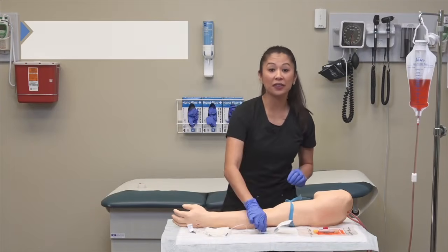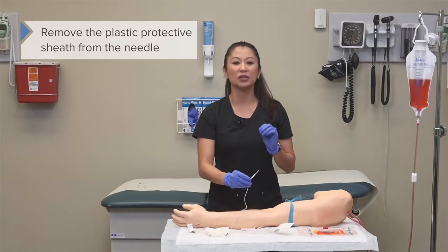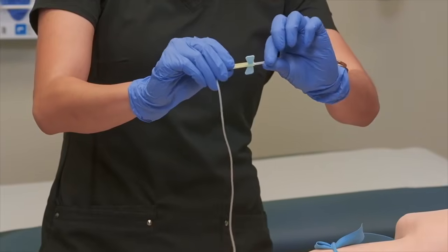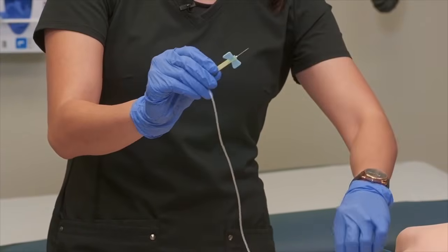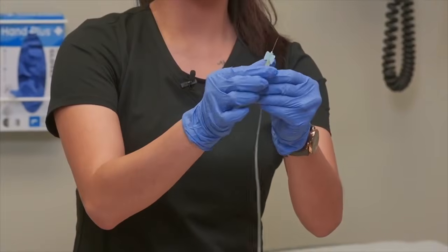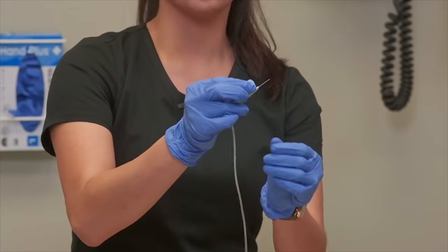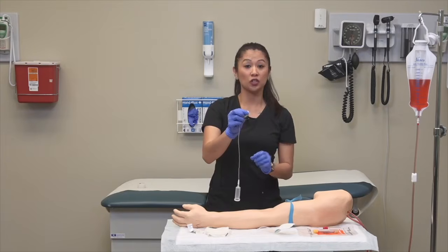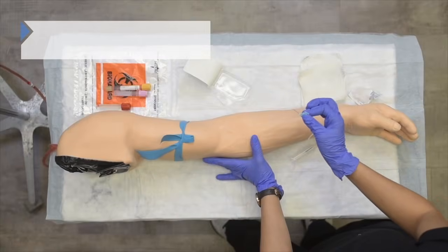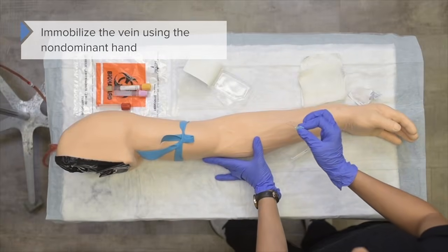Now once you've done that, we can remove the plastic protective sheath from the needle. So this is the plastic part and I'm going to pull straight out. And this is what's great about these needles. They have these little wing devices that I like to hold on to for the insertion of the needle. Now once I've done this, I can immobilize the vein using my other hand.